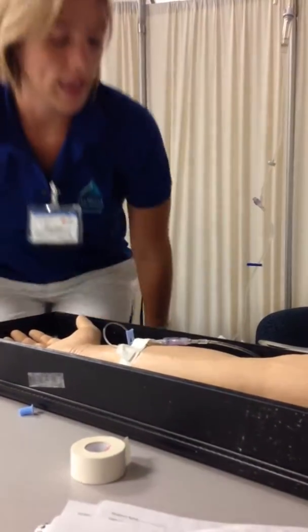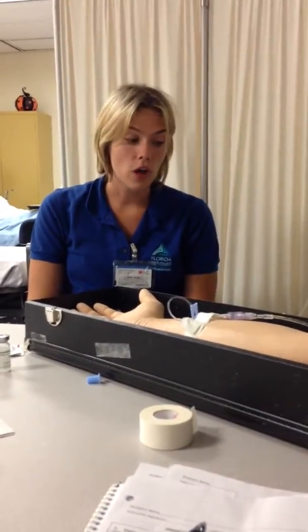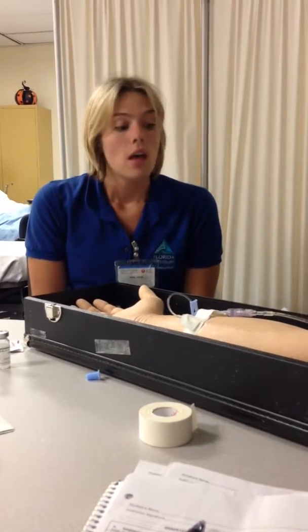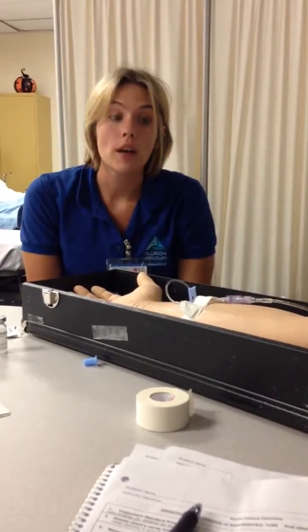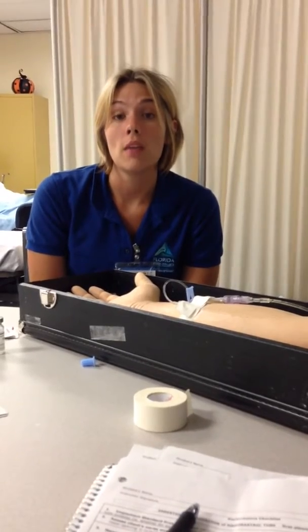Now I need to document on my MAR the medication that was administered: the time, the drug, the dose, and the route. The drug was Flagyl, the route was IV, 500 milligrams, at 17 drops per minute. I also document the condition of the IV site, which is great, that the patient tolerated it well, and record the volume. That is IV piggyback administration.